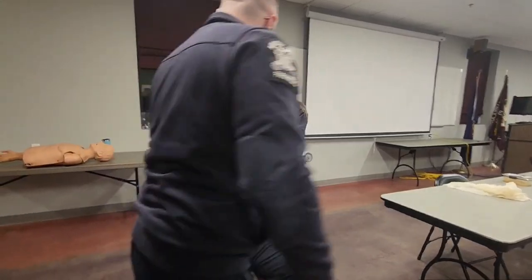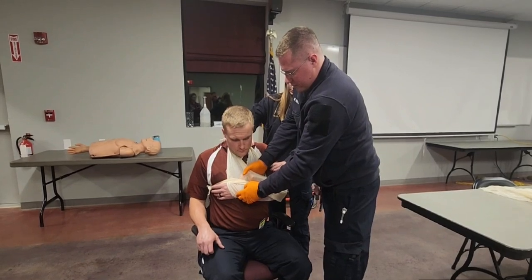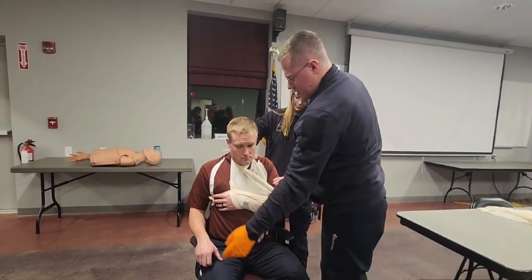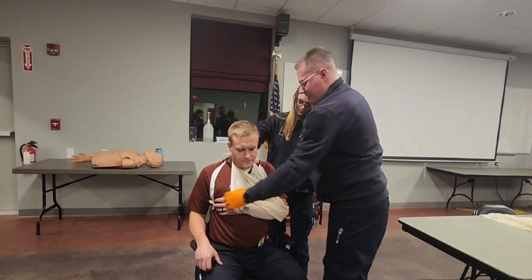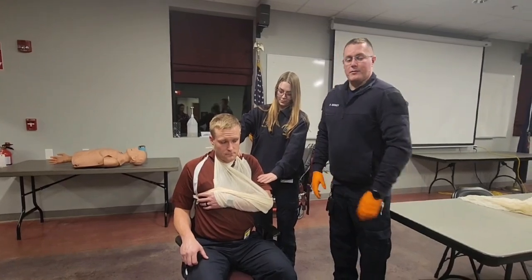I'm then going to reassess his sensory, motor, and circulatory functions. I'm going to check for a pulse, which is present. Have you wiggle your fingers again. Close your eyes. Which finger am I touching? Motor, sensory, and circulatory functions are present and normal. I'm done with the station.